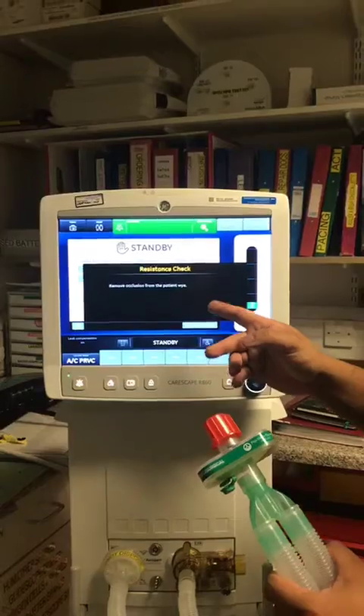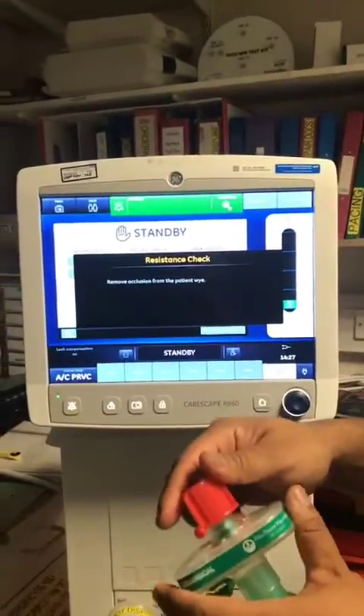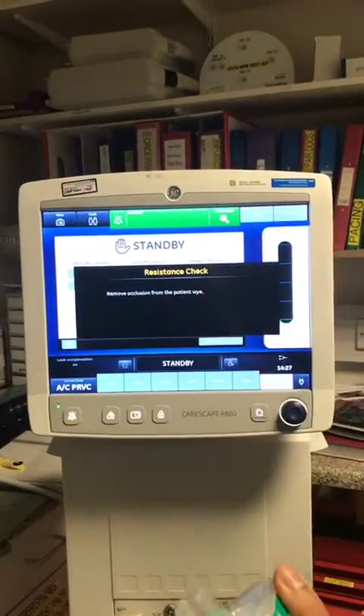Coming towards the end of the test, it says remove occlusion from the patient airway, which basically means remove the red bung, which you do like so.